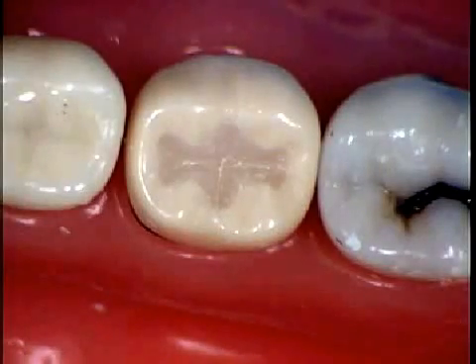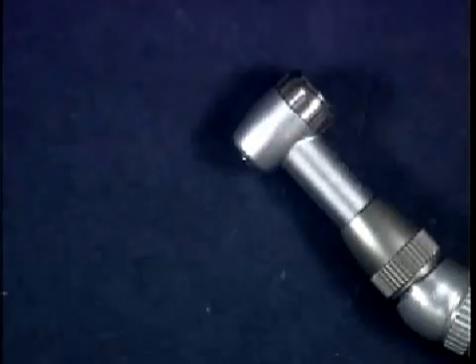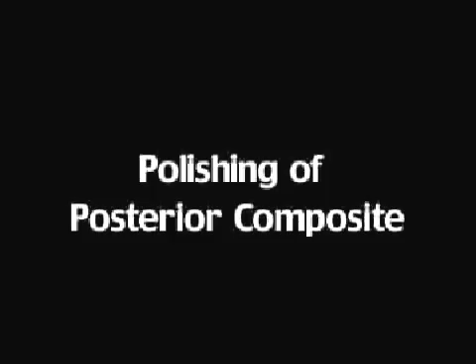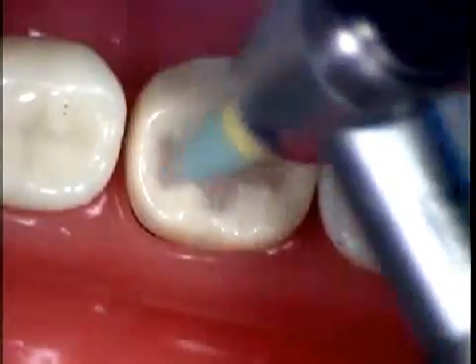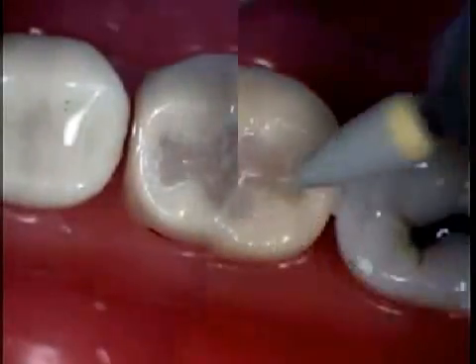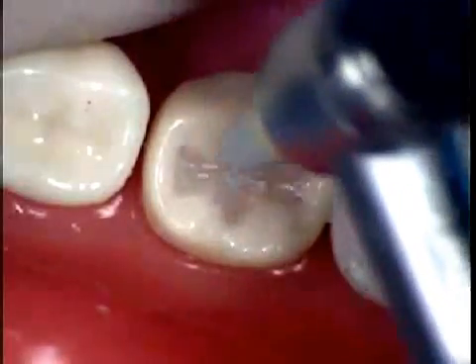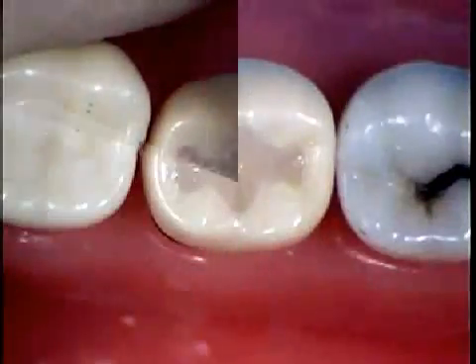After you are done with the finishing, you are going to start the polishing with the green polishing point. To use the polishing point, you are going to need to mount the slow speed. After you mount the slow speed, press the head of the latch and place the rubber point inside and lock. You should use the green polishing point with water. After you are done with the green polishing tip, you use the gray polishing tip. You don't need to use heavy pressure when using the gray tip — light pressure is fine.